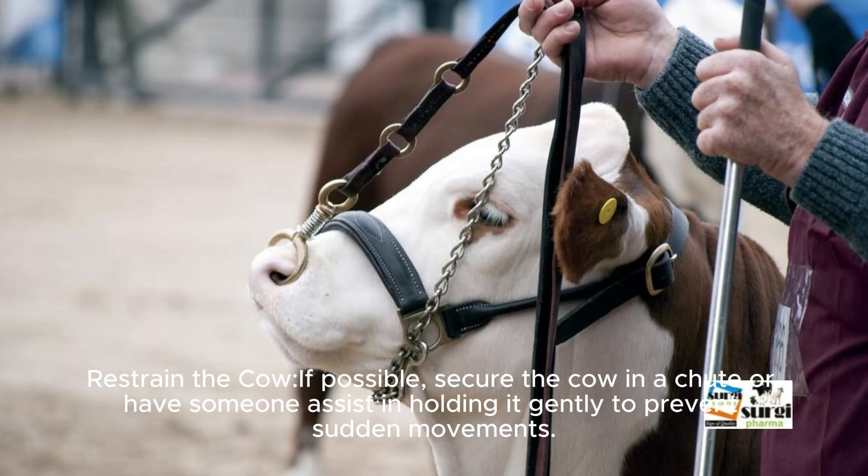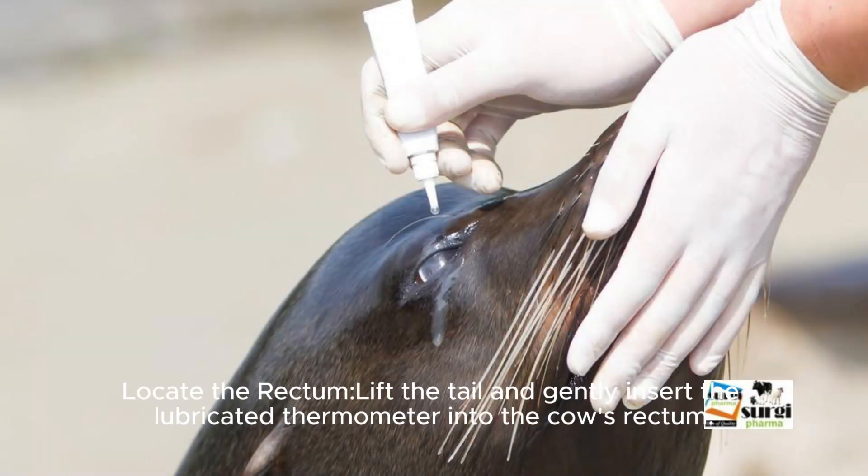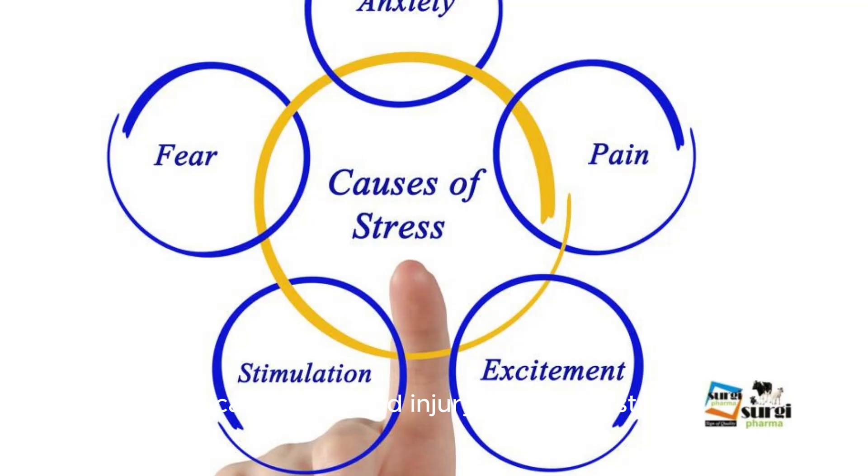Restrain the cow. If possible, secure the cow in a chute or have someone assist in holding it gently to prevent sudden movements. Locate the rectum, lift the tail, and gently insert the lubricated thermometer into the cow's rectum. Be careful to avoid injury or causing stress.